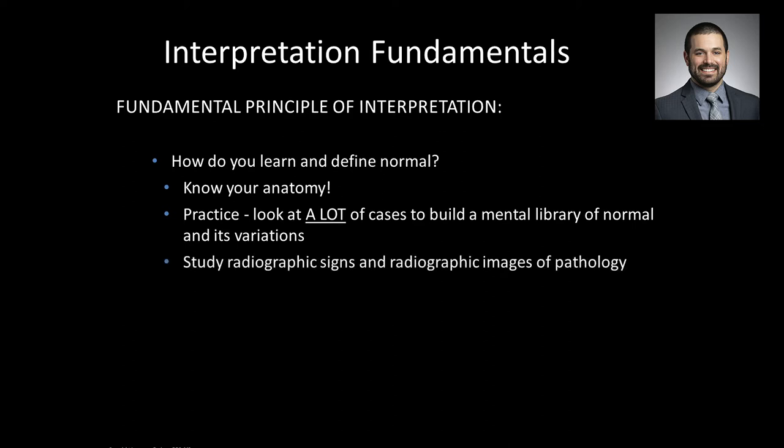You do also, though, have to study radiographic signs and images of pathology. So you can come and join one of our courses or get a dental radiology textbook and page through and look at the images. But matching this, knowing normal anatomy versus variations versus abnormal, and then studying what disease actually looks like, putting that all together is your best approach to successfully interpreting a cone beam CT scan or any dental radiograph for that matter.